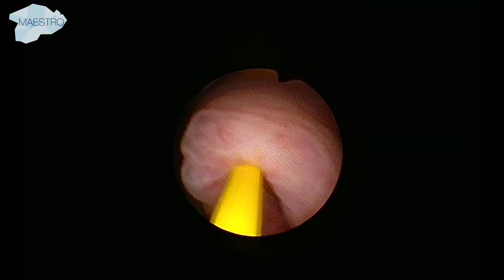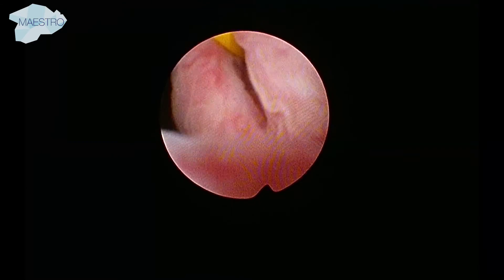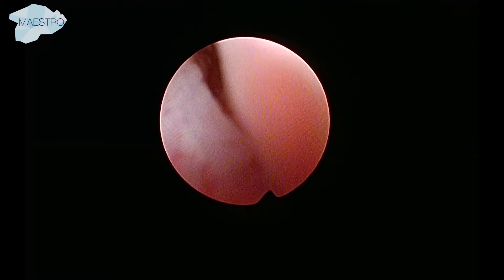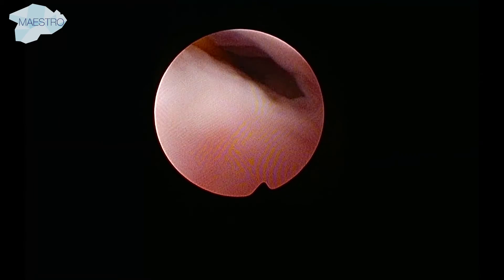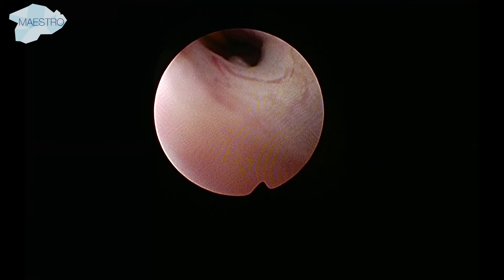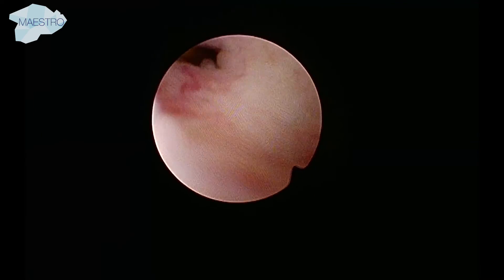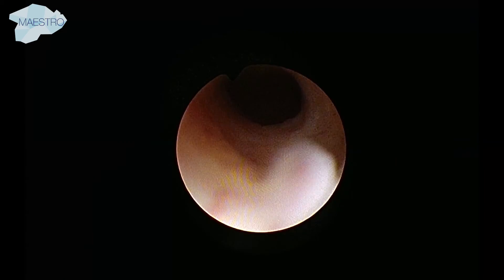However, sometimes it is difficult to enter the ureter. The scope can be inserted by turning it upside down and using the beak of the scope to dilate the ureter so the scope can progress into the distal ureter. The black notch indicates the 12 o'clock position. When the scope is inserted, the surgeon can turn it back to the standard position and proceed with the examination.